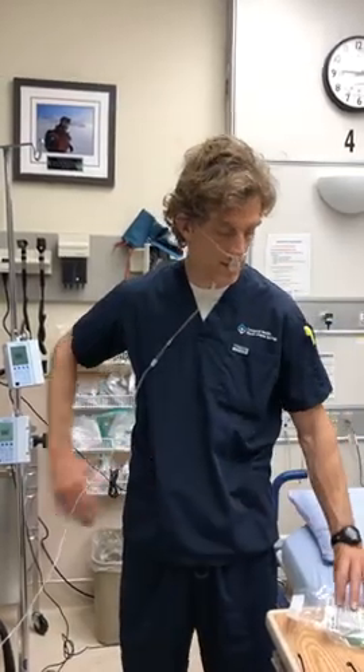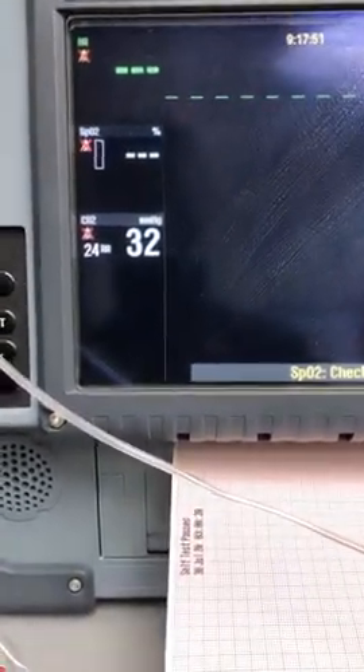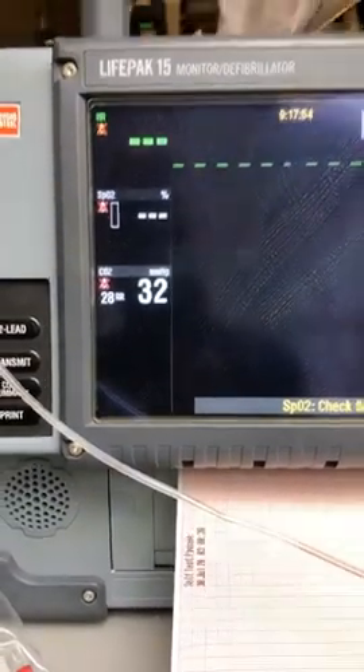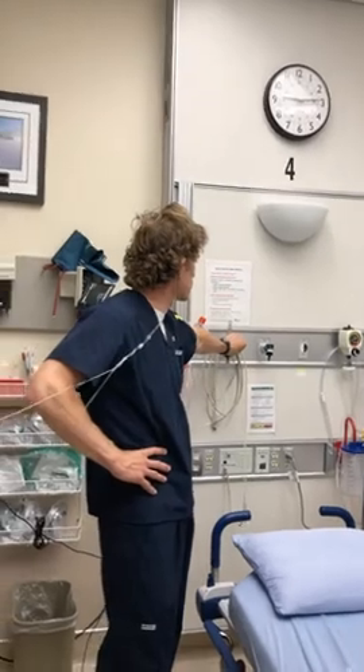I'm on room air now. I have no flow going through this same device — the Smart CapnoLine Plus O2 for end-tidal CO2 monitoring in the non-intubated patient. I'm going to demonstrate what flow does to our ability to monitor CO2. Right now I'm talking so my respiratory rate's a little bit higher, but you'll see the end-tidal CO2 is 32, which is pretty normal. We've been playing with this for a little while and it stays in that range. Let's see what flow does — we're going to go up to 4 liters per minute initially.